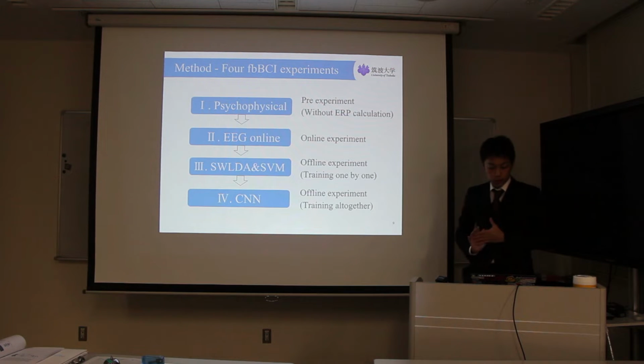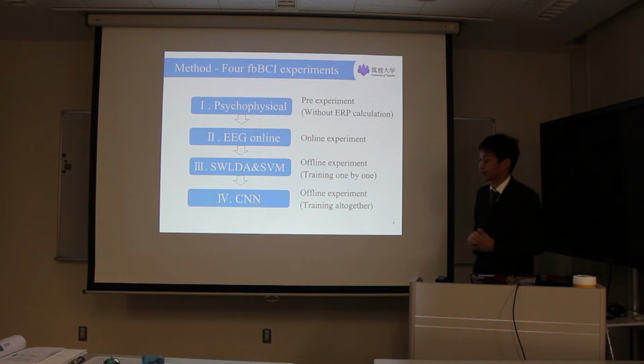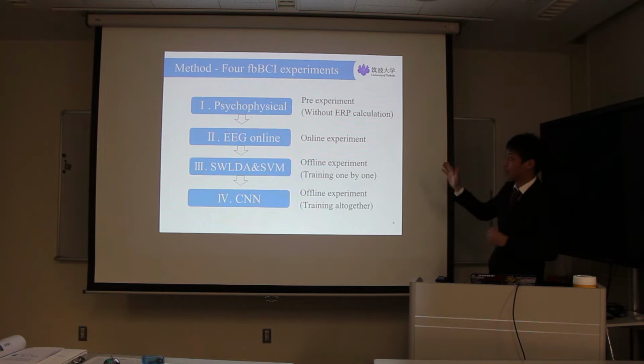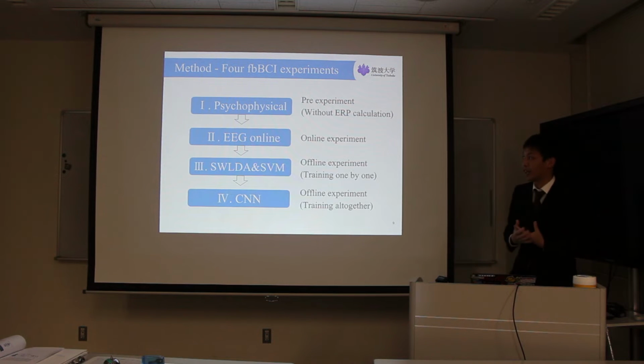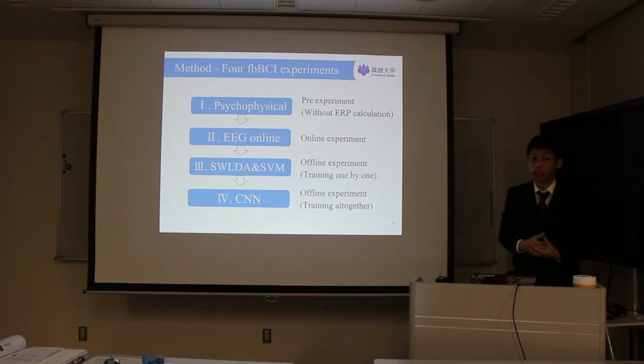So to validate the FBBCI paradigm, we conducted 4 experiments. The first experiment is a psychophysical experiment. This is considered a pre-experiment before the EEG experiment. The second experiment is the EEG experiment, which is the most common, usual experiment. We conducted experiments 1 and 2 simultaneously.